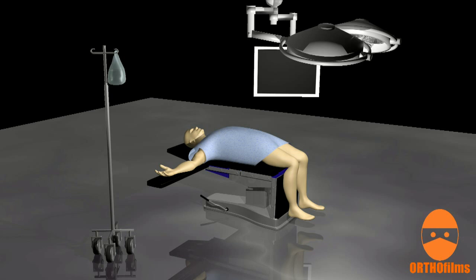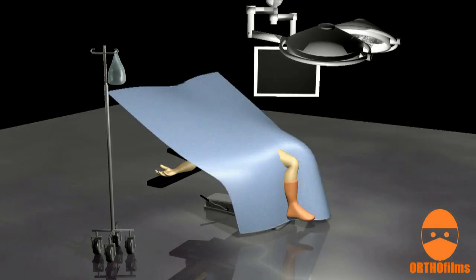The patient is placed under anesthesia and positioned for surgery. The knee is prepped and sterilized, and sterile drapes are placed around the knee to prevent contamination.